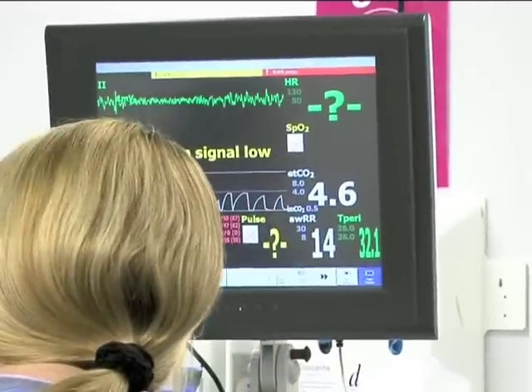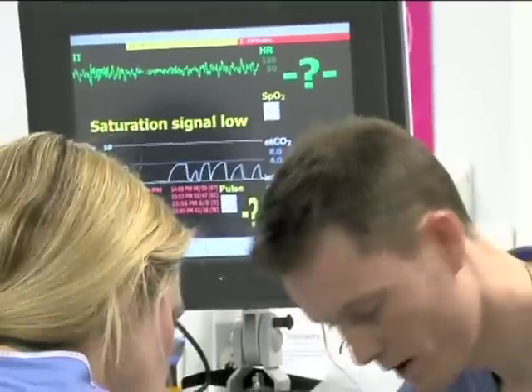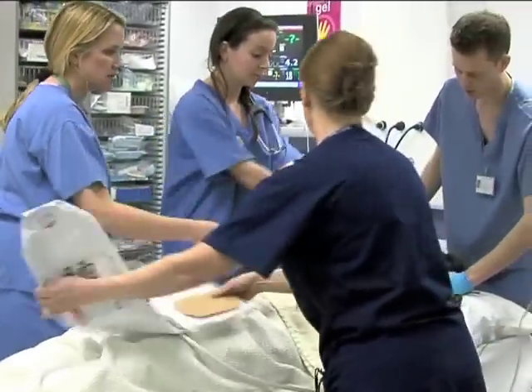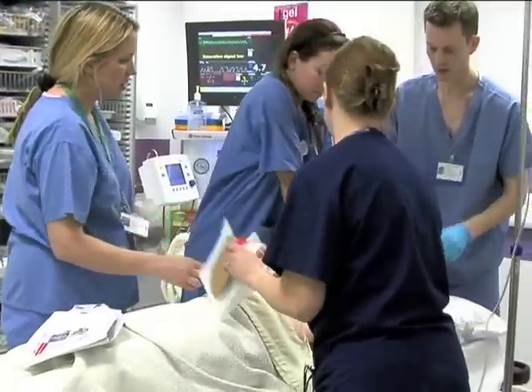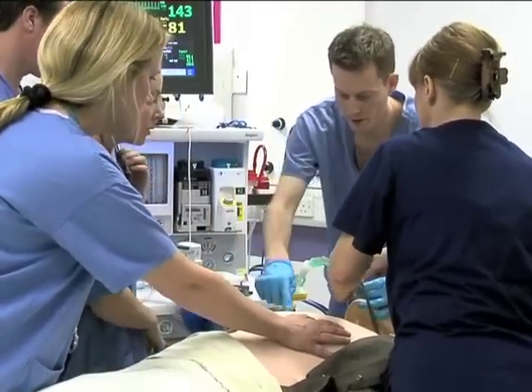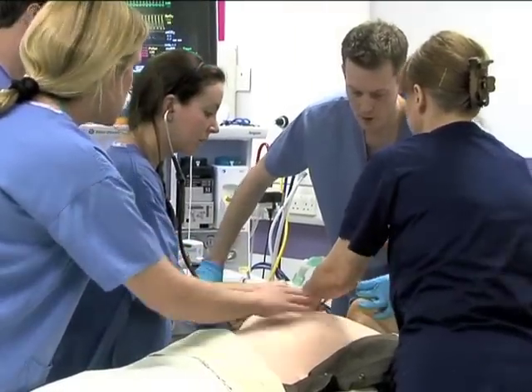The setup that you see behind you is there's a real anaesthetic machine, a real crash trolley, there are piped gases coming out of the wall, exactly the same environment as you would get elsewhere in the hospital. We can replicate a ward or a theatre, or as in today we're set up to represent the emergency department. But this is the actual equipment, it's not pretend. It was very realistic actually.